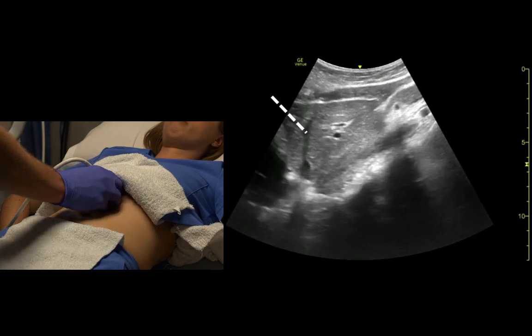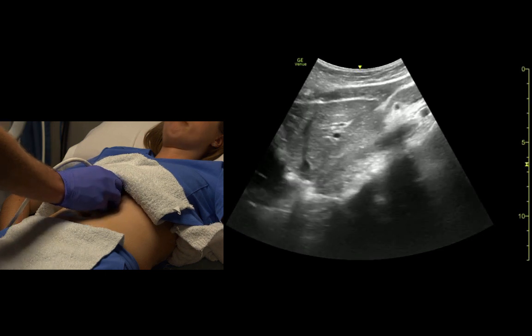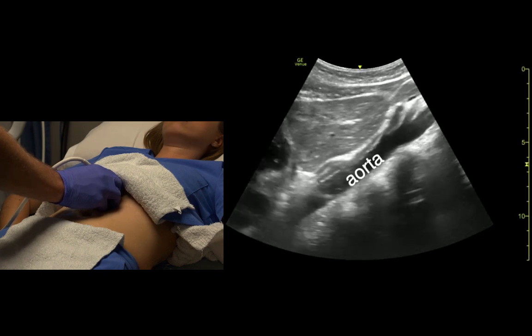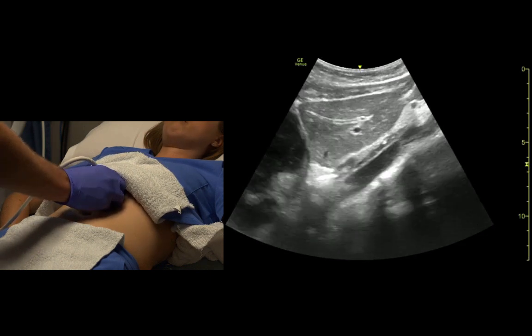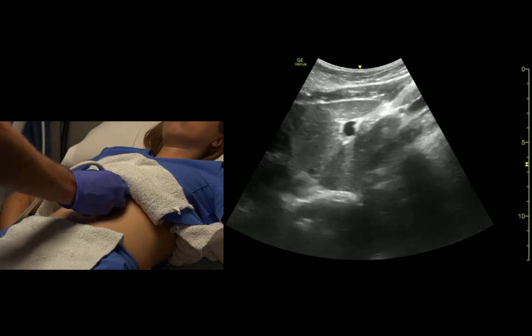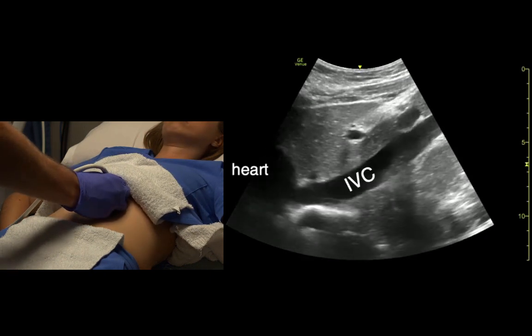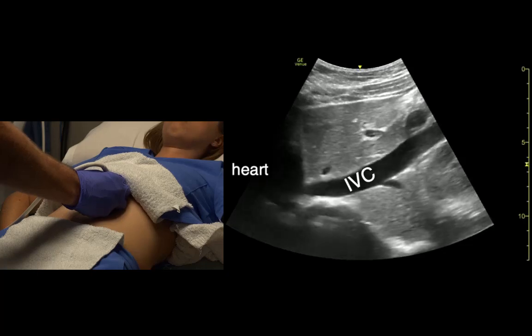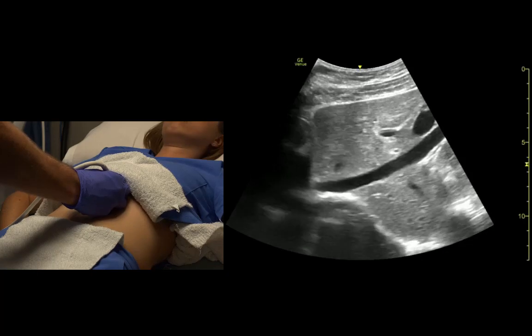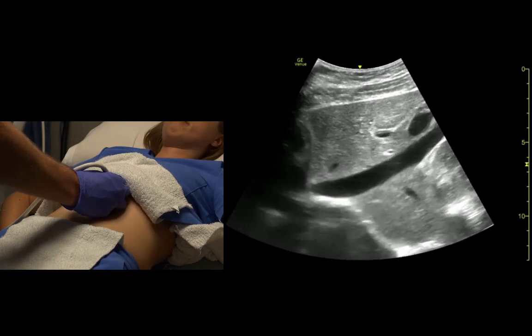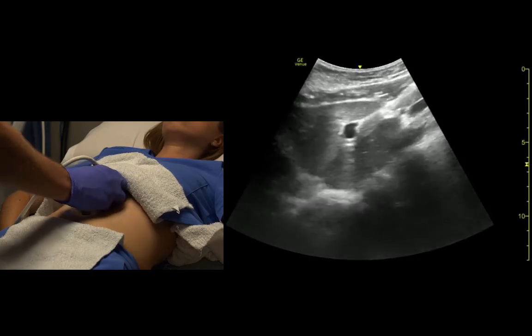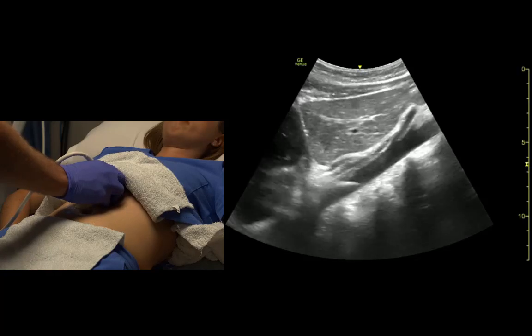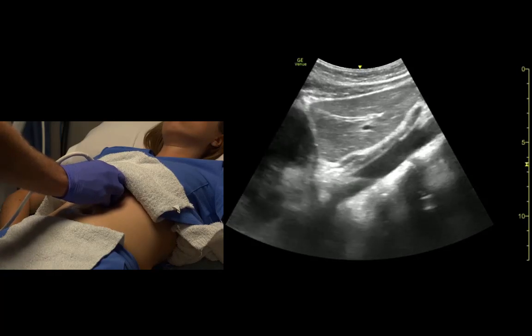The middle hepatic vein drains into the inferior vena cava. The aorta runs behind the heart, and the IVC runs into the heart — you can see it collapsing and changing. We see liver on either side of the IVC, whereas behind the aorta there's no liver.